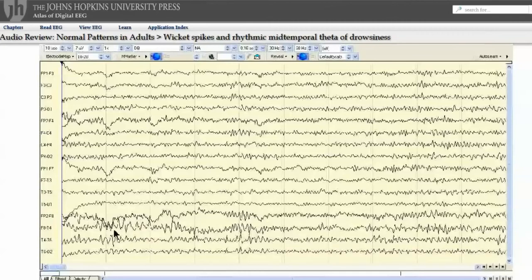If you look more closely at the morphology, you will see that there is a notch pattern. Here the black arrow shows the notch, then the potentiated alpha frequency, then a notch, another potentiated frequency, and now for the next three waveforms, notches that appear at different parts of the alpha wave. Here on the upside, here on the downside, and on the next wave also on the downside. The third wave also has a notch on the way down.